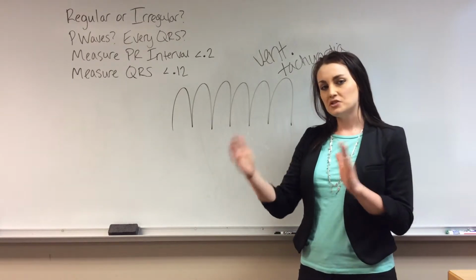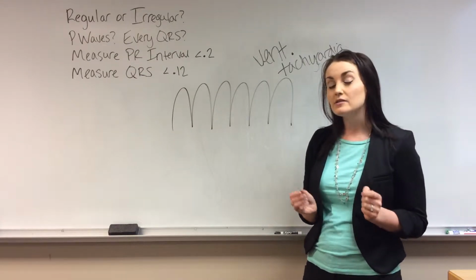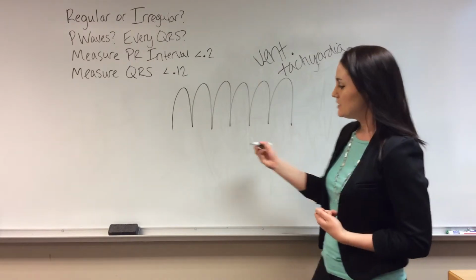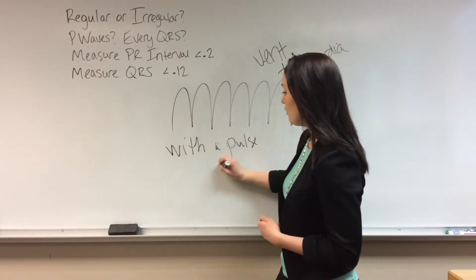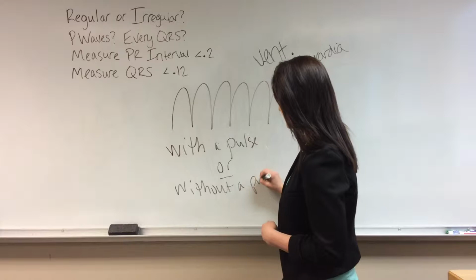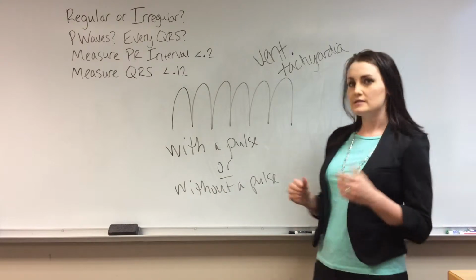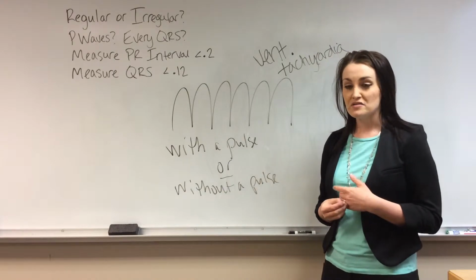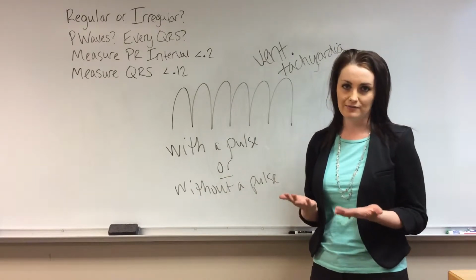So that's just an error. But aside from that, if it is true, real ventricular tachycardia, it can be with a pulse or without a pulse. Sometimes patients can perfuse these beats. That's where the patient assessment really comes into play. You would want to instantly check your patient: are they sitting there talking to you, whether they feel good or not so good? If they're sitting there talking to you, they have a pulse with their VTAC.